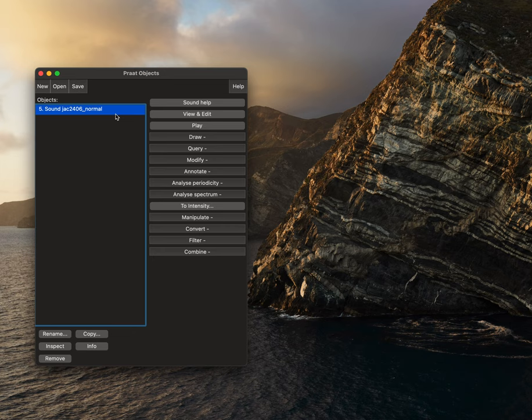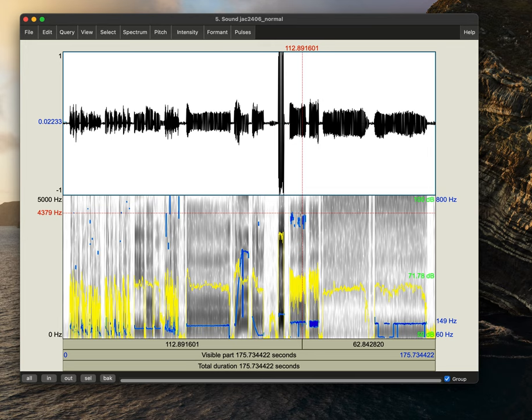Okay, so all of that has been previously recorded here. The first thing I'm going to do is click view and edit. Here is our sound waveform and our spectrogram with our intensity signals in the yellow and our pitch contours in blue.